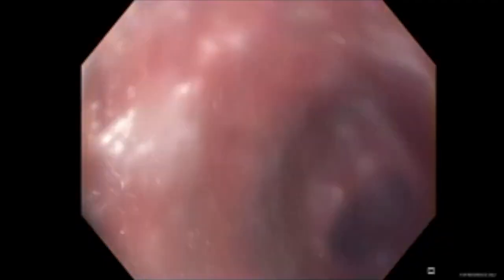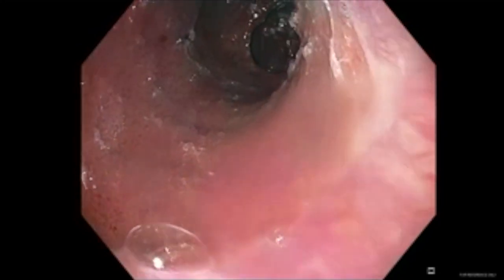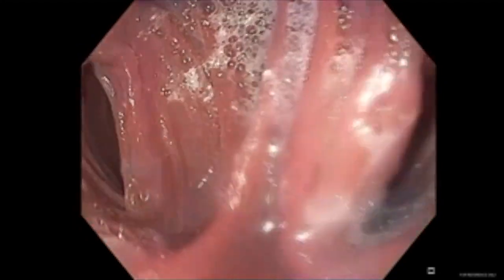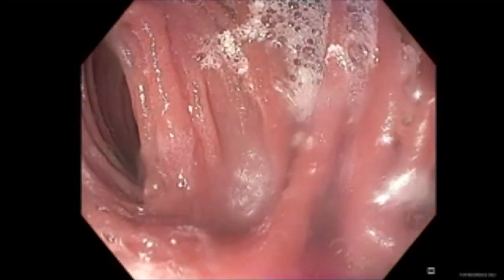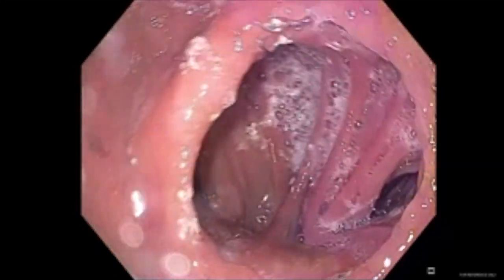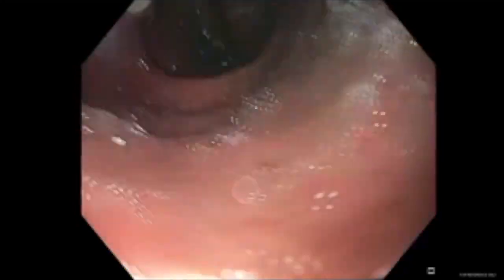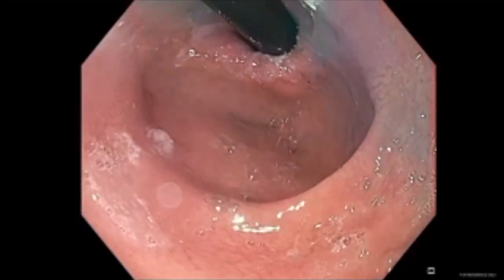Careful endoscopic evaluation of our previously described patient involves first evaluating the gastric pouch for any evidence of fistula, also for pouch dilation, and finally for measurement of the aperture of the gastrojejunal anastomosis. The pouch length can be measured with the scope from the gastroesophageal junction to the edge of the anastomosis. The area is then carefully examined for evidence of ulcerations or disrupted sutures or staple material. The gastroscope is then retroflexed to evaluate for any evidence of more proximal fistula or post-surgical pathology.